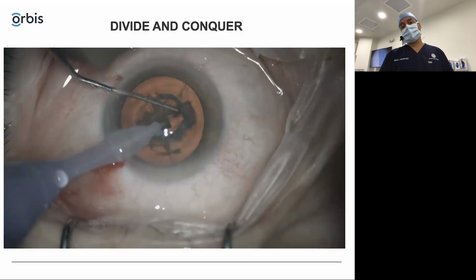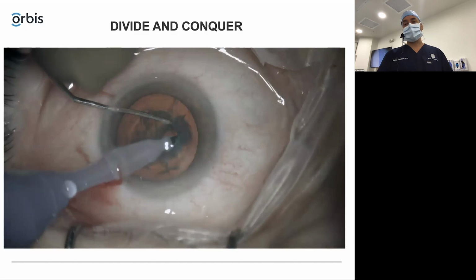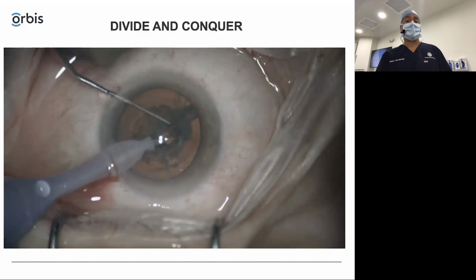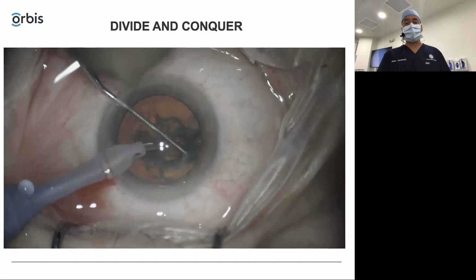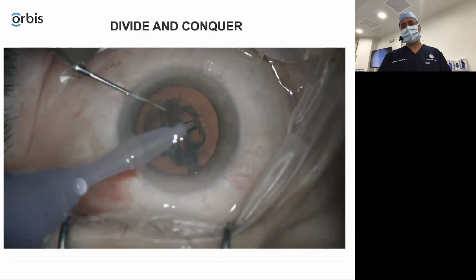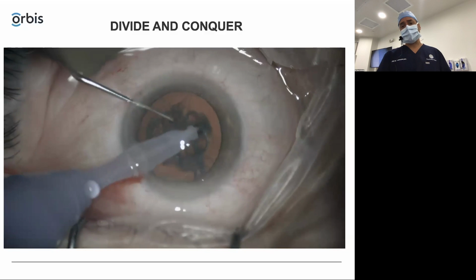So again, when I was learning phaco, nobody taught me, hey, how deep should you go? I thought, do I need to get as close as I can to the posterior pole? Not necessarily. Once you start to see those striations perpendicular to your phaco tip, that tells you that you're at the right depth to crack.